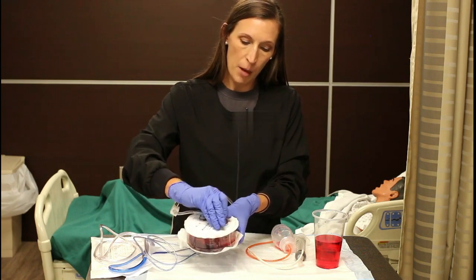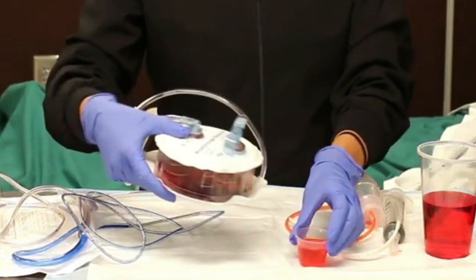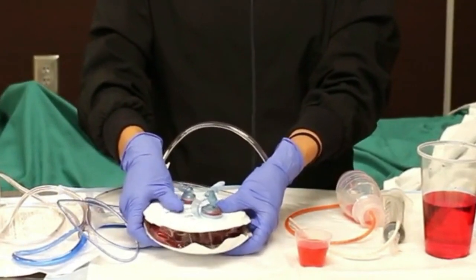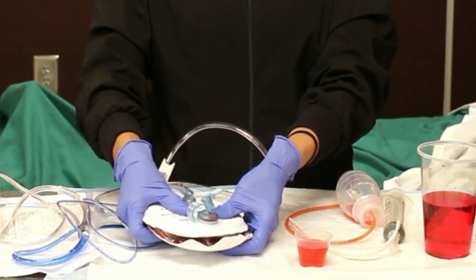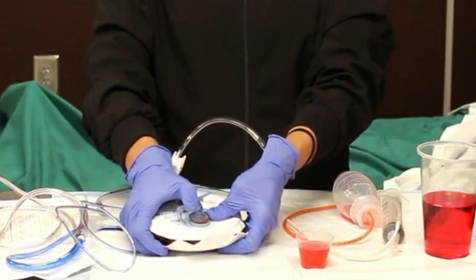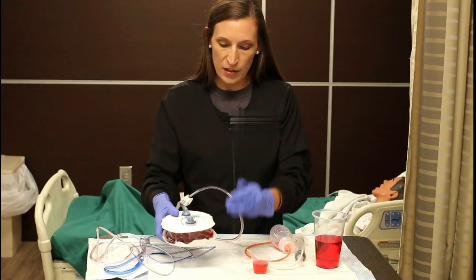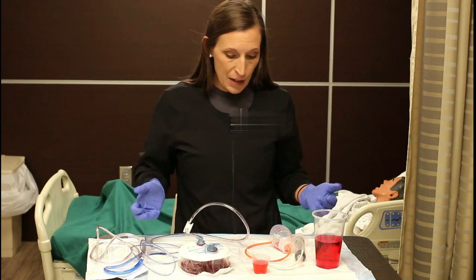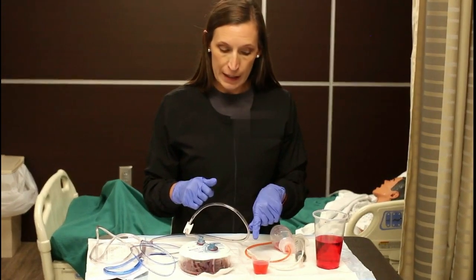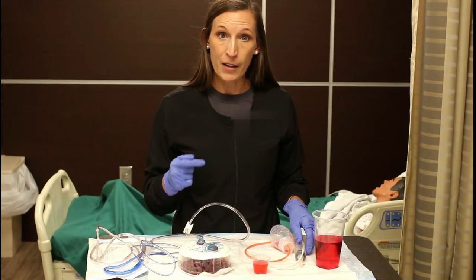This one has the clamp on the top, so you would open it, then empty it into your measuring device, then squeeze the accordion down. Make sure you're protecting your eyes as you're squeezing this. You would wipe the lid off, clamp it back, and when you let go that creates the suction. It works exactly the same way, just a different style. Make sure you document how much you got out, what color it is, and it goes on the output for I&O records.